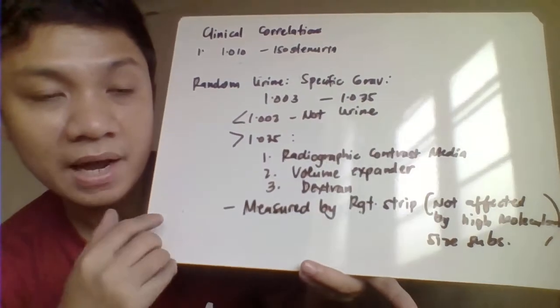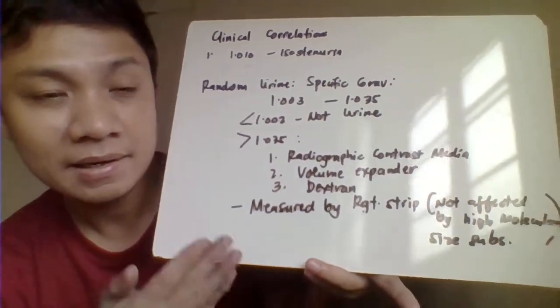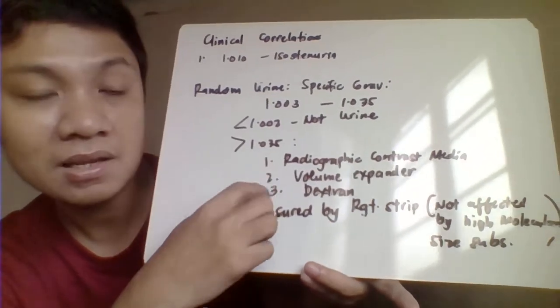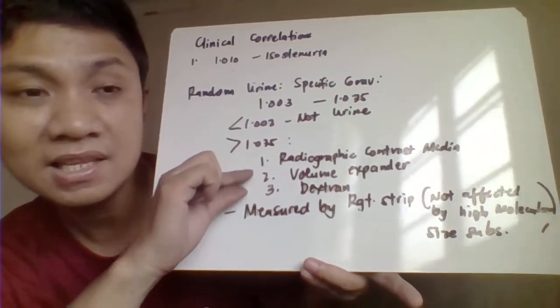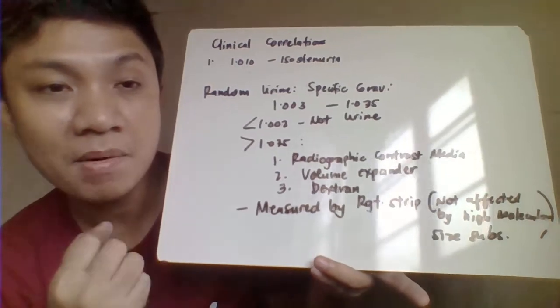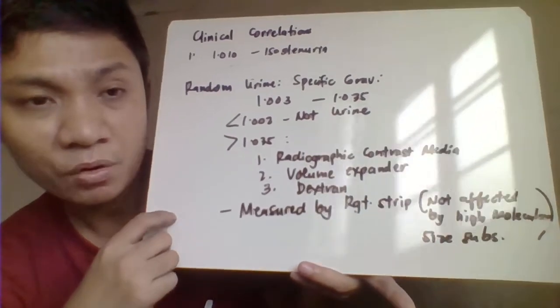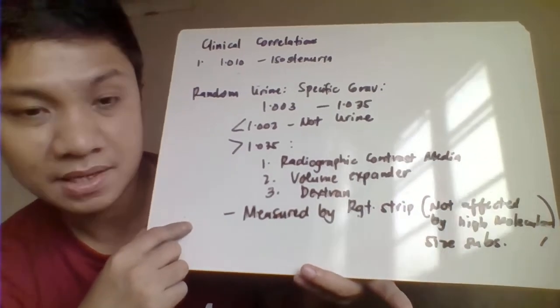Therefore, it will give you an exact reading of your specific gravity, regardless of whether these are dissolved, because they are not really representing the amount or the concentrating ability of our kidney or its ability to reabsorb substances.